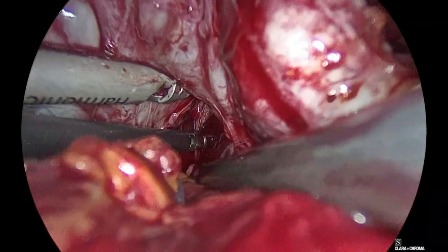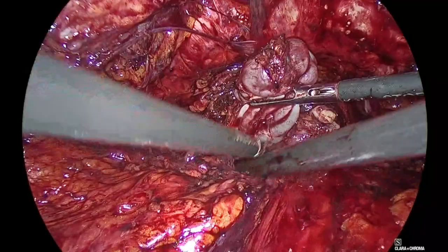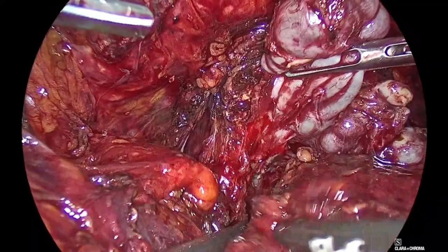Okay, go back. Hold this. Panagiotis, lift it up. Hold this here. Good. We start with the nerve sparing on my side now. Stay down here. Panagiotis, here. Initially here. I want to see my field here.